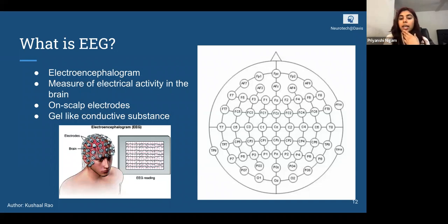So how it works is you measure the subject's head. You can see on this little map here that you would place the electrodes based on that map. First you would measure them all the way across, and all the way across from ear to ear. Basically you can use this map. And naturally, as we go about making projects, we'll learn a little bit more about how we would map it and put them on their head.